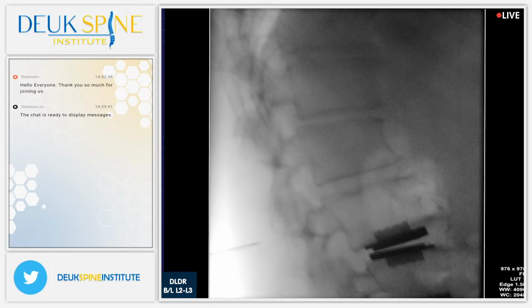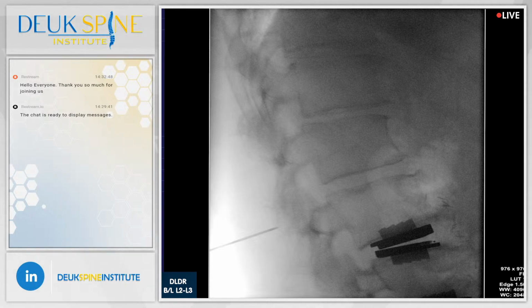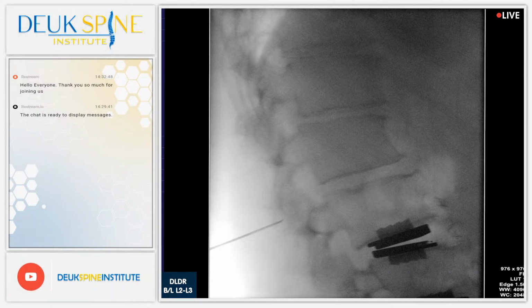First, I'm going to give some more numbing medicine because we're passing through the skin, fascia, muscle to get to the spine. And we're going through a natural opening that's already there. It's called the neural foramen. The neural foramen happens to be where the nerve root exits. Let's see. Shot. All right, so we're aiming for the disc at L2-3. I feel the facet. I'm on his facet joint. Now I'm going to go around that facet.